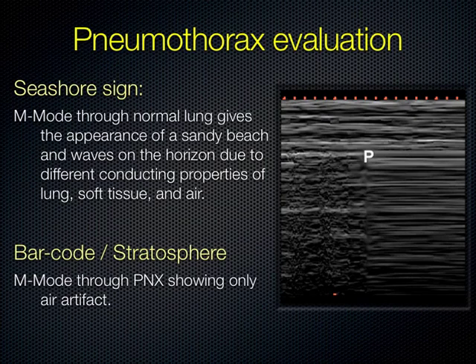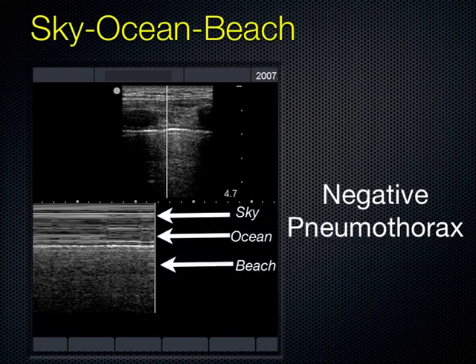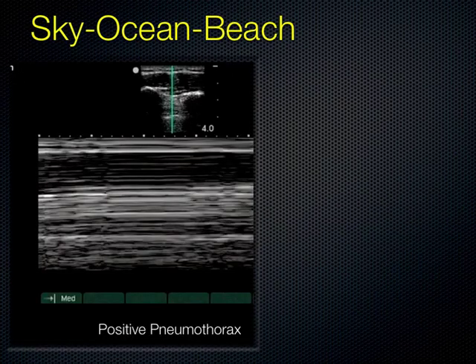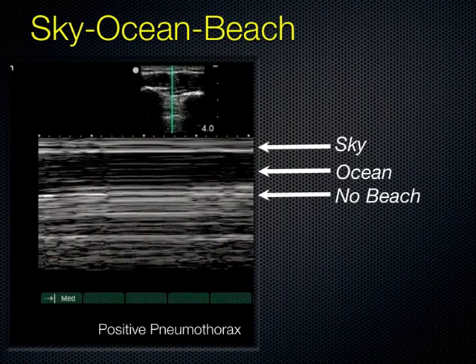Here's an M-mode example through the pleural interface: you can appreciate a definite sky, with the pleural line as the horizon, and a beach more inferiorly due to the motion of the lung. By contrast, an upper picture with A-lines could be pneumothorax or normal, but when you put M-mode through it, you have no beach — just a barcode. That's a pneumothorax. In your models today, if you ask them to hold their breath carefully during M-mode, you'll be able to see the stratosphere sign and barcode — because if the lung's not moving, you won't get that graininess.